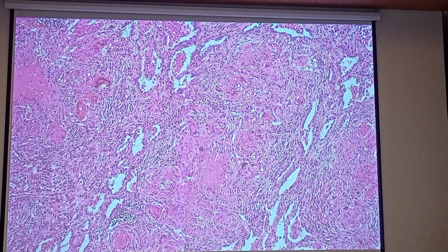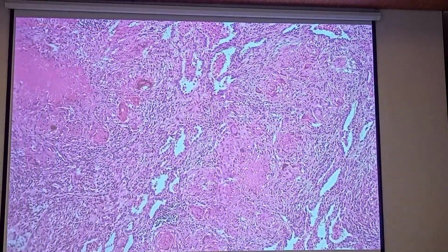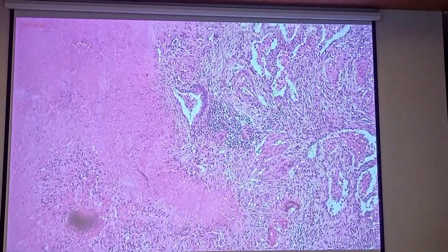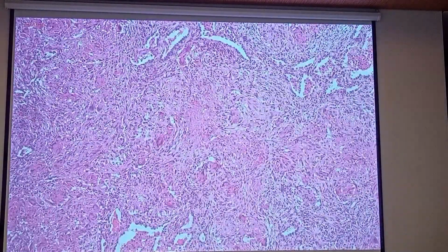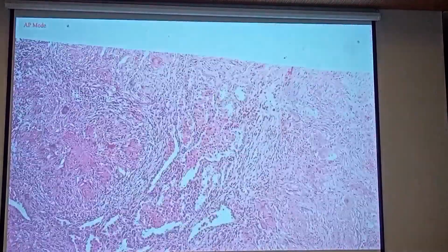with the nucleus located at the periphery. Sometimes it may have a similar configuration of a horseshoe pattern. So, yan ang Langhans type giant cell. Essentially very, very indicative of tuberculosis. Mycobacterium tuberculosis infection. So, yeah.